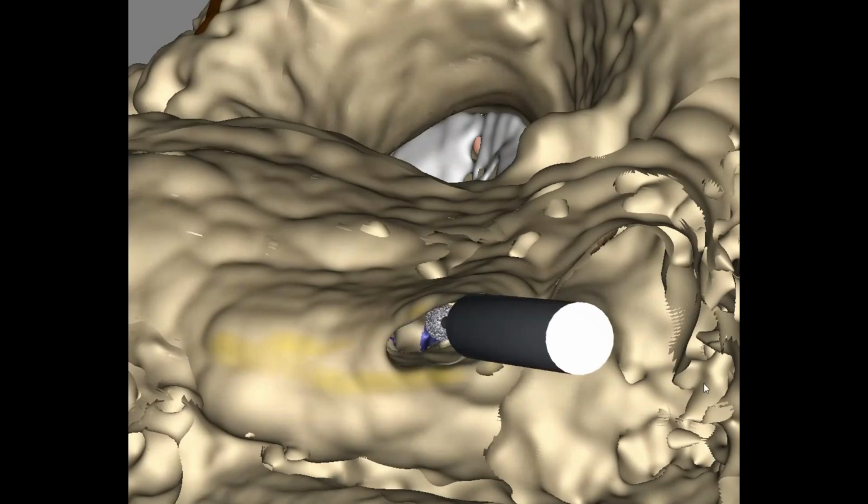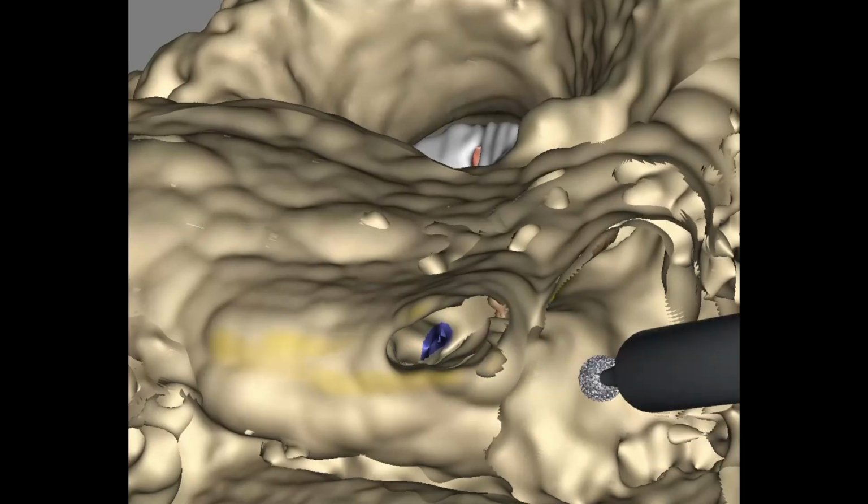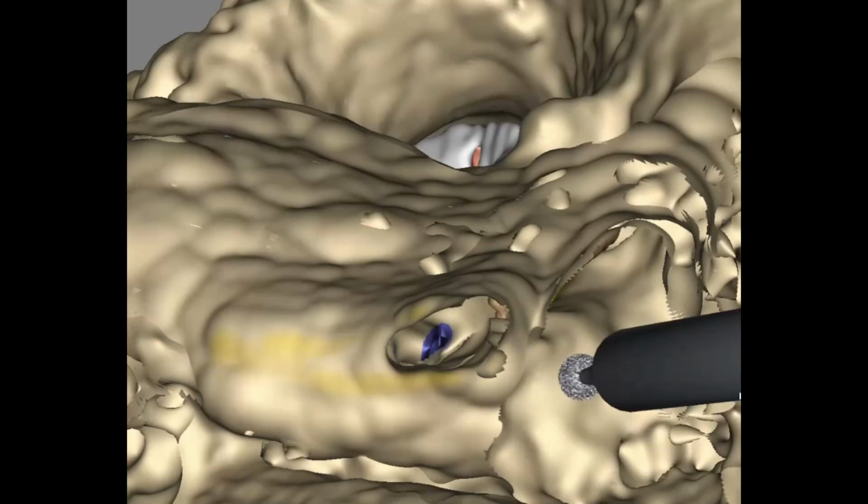If the bone in this region has no air cells, then drilling the tympanotomy can be a hairy ride, but one that must nonetheless be taken. If in doubt, stop and review your anatomical landmarks. A nerve monitor can be useful, but it may also confuse. Again, there is no replacement for a solid understanding of the anatomy.